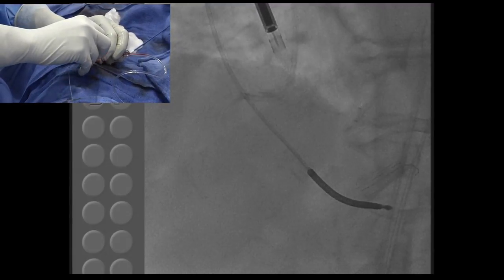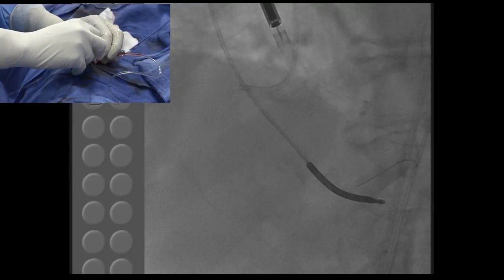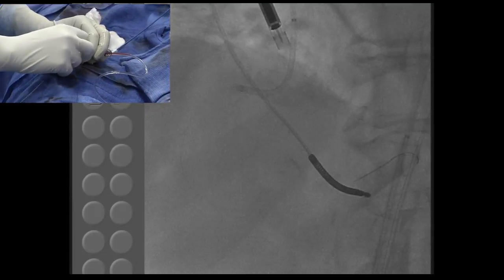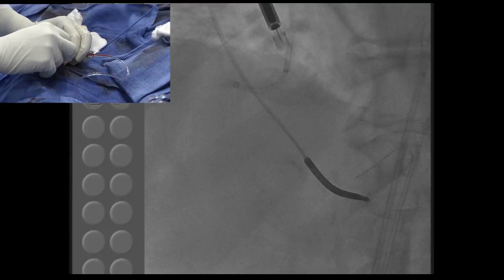Single long stent or two? I think if the guide liner depends, it can go further. Guide liner, and give me a balloon. Give me a new balloon. What balloon do you have? Okay, good. Give me a 3.0 30 long balloon.